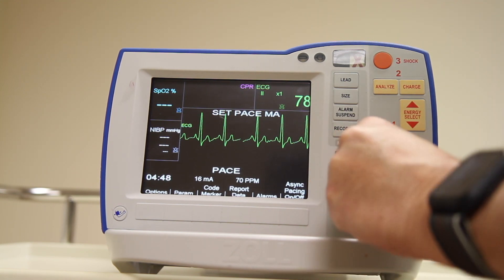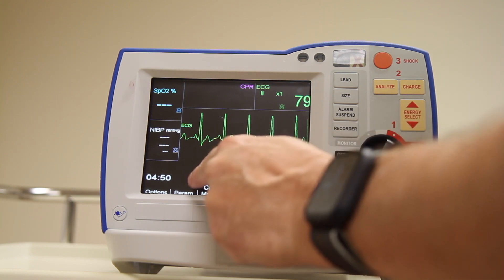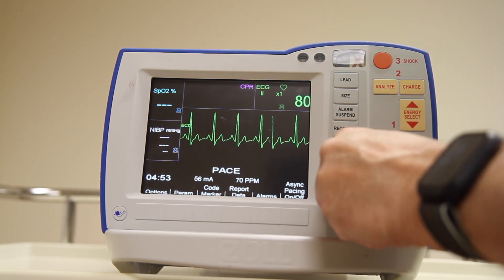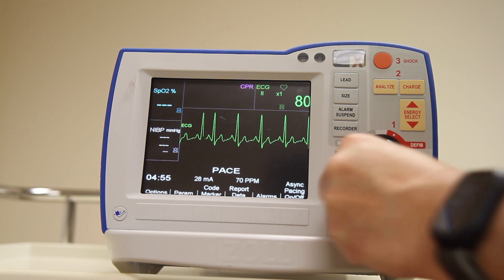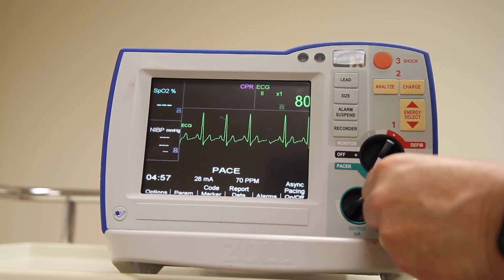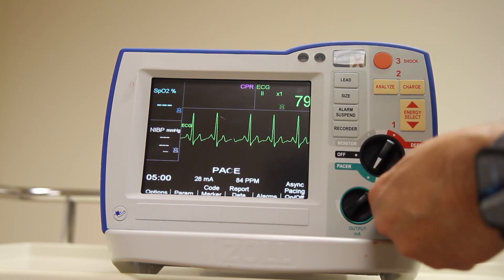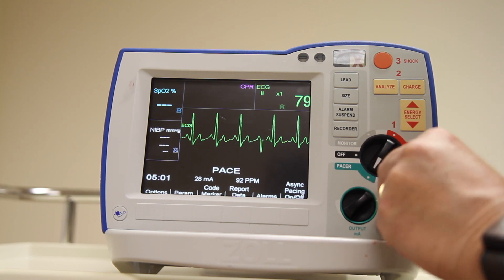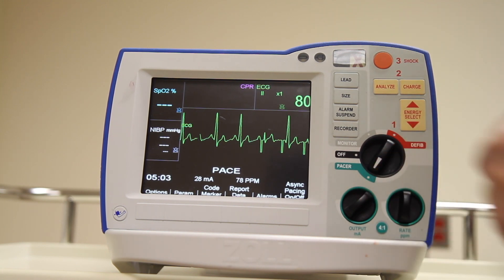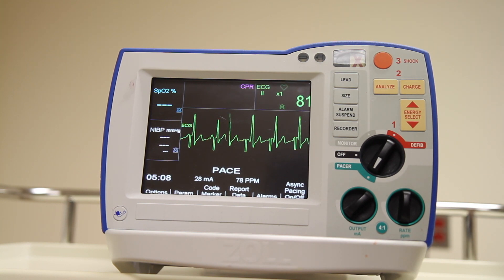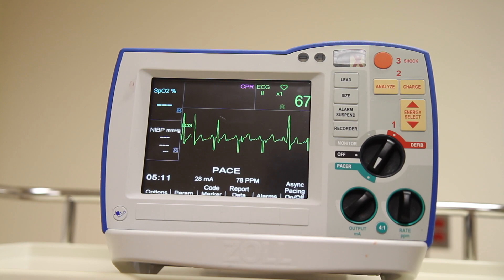Along with the dial to put the device into pacemaker mode, we have two dials beneath it. One is an output dial: when we rotate it, it moves the milliamperage up or down. Next to that dial is a rate dial that moves the rate up or down. You are responsible for determining an appropriate energy setting to start at and a target heart rate for the patient.